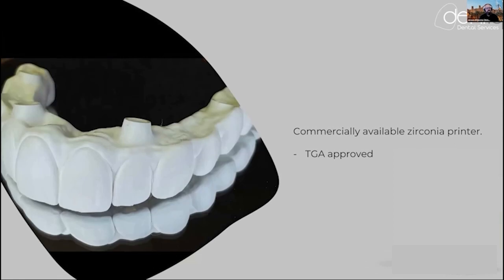Let me show you, for example, this one. And this is the great thing: we cannot mill this accurately because we have the limitation of the size of the milling burr. And we don't have that problem when we do additive manufacturing like 3D printing. This full arch crown, or full arch bridge, I have to say, sorry, is just out of the printer. I have not done anything. I have not made any adjustments to it. So you can see how accurate it can be.